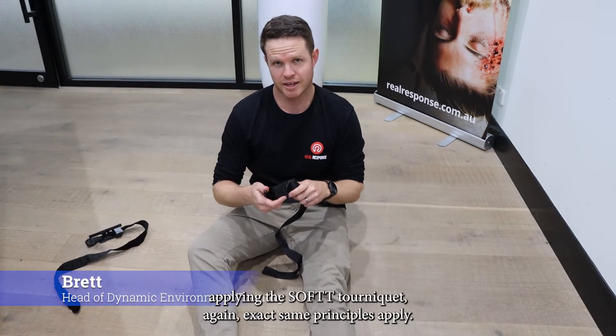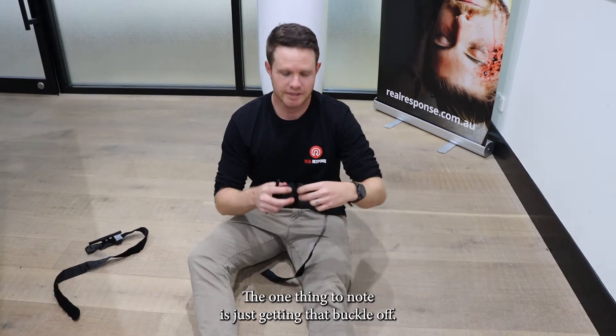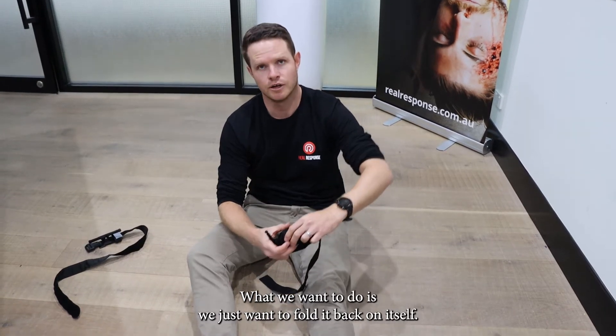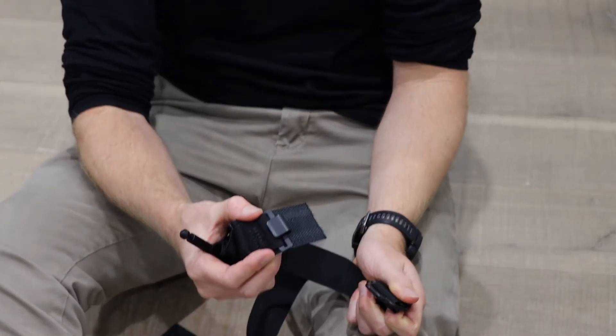When it comes to applying the SOFTT-W tourniquet, the same principles apply. The one thing to note is just getting that buckle off — we're not trying to rip it. What we want to do is fold it back on itself, and then twist it out of that clip.